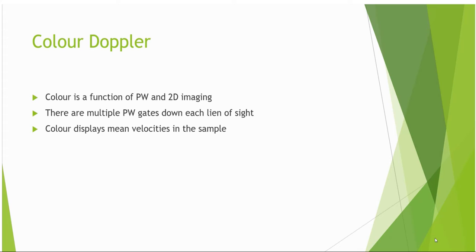We can also see that colour pixels are much larger than that of 2D. In many instances, colour may be displayed outside the vessel wall or chamber. Colour may also overwrite the 2D display so that tissue information is lost. To combat these problems, write priority can be adjusted. As the name suggests, it gives priority to what is displayed at various levels, colour or 2D.